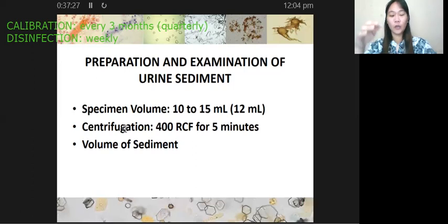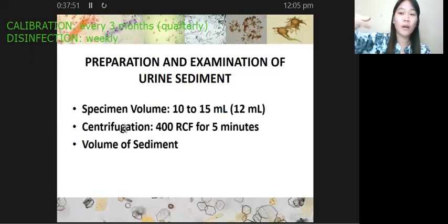Alright, so centrifugation. Ayan. So after centrifugation for 5 minutes, alright, so of course, you have to decant. Okay. Alam ko, dinemonstrate din ito ni Sir Ruben ng maayos doon sa ating video. Sabi nga niya, pag nagdecant ka, huwag kang matatakot. Okay? Basta itaob talaga. Basta ang gawin mo, okay, you decant. Ayan, you decant lang.